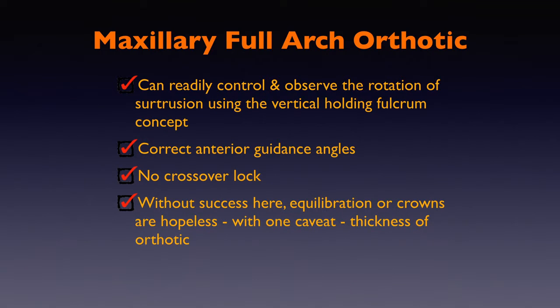If the patient's MI required severe detrusion, then the orthotic will be quite thick in front in order to have sufficient material in the back to adjust for the required surtrusion.